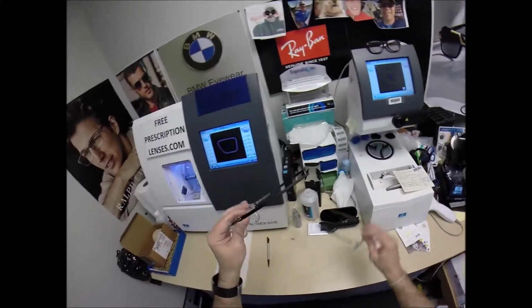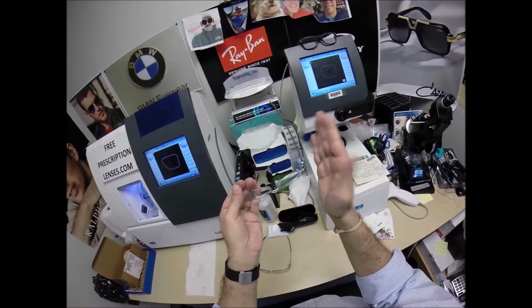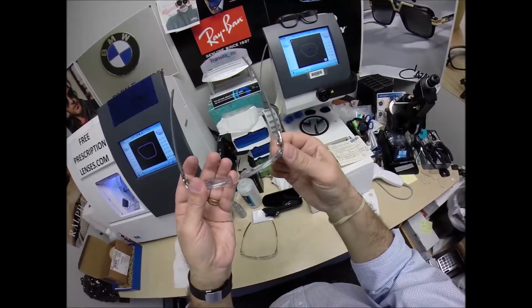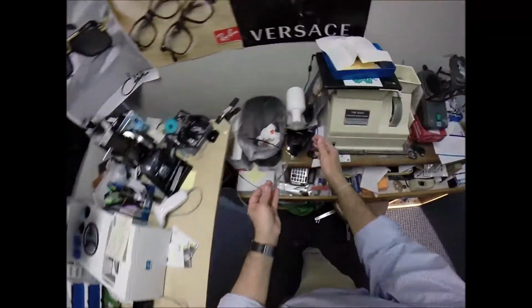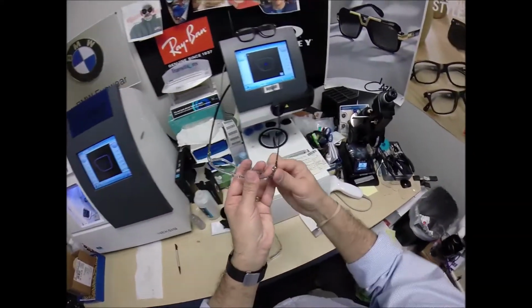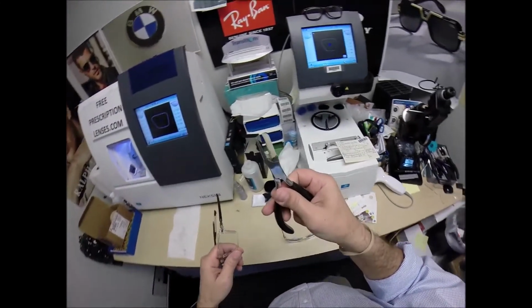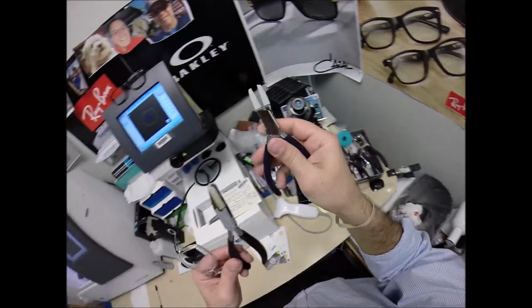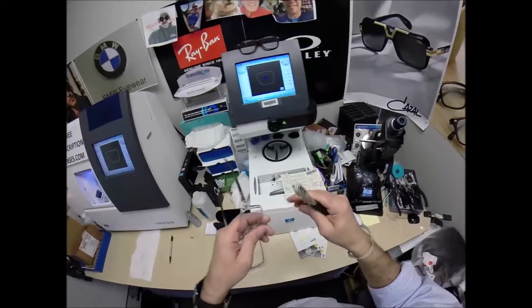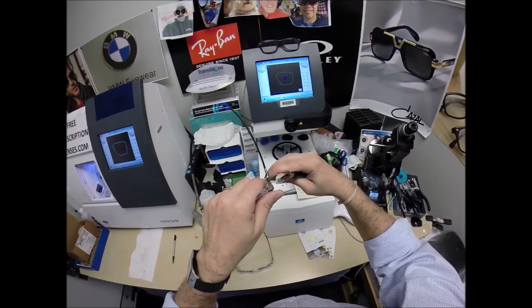It also means now these probably, I know my carbon fibers cannot be bent down, but these can be brought inward here using heat. Right there, you can do that. Have any optician who's doing this for you remove the lenses, apply heat to the hinge. You can either use your hands, the table like that, or a pair of single padded pliers. That means it's only padded on one side versus double padded pliers. But once it's heated up, the metal goes on the inside, plastic on the outside, and then you can just turn it inward. To loosen it, you would pull it outward once it's heated up.